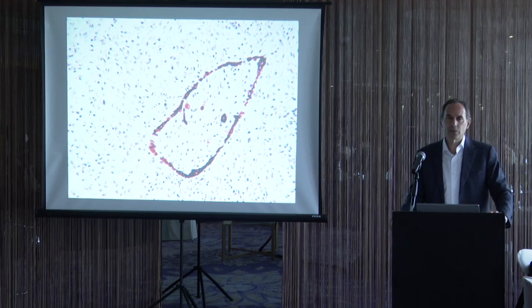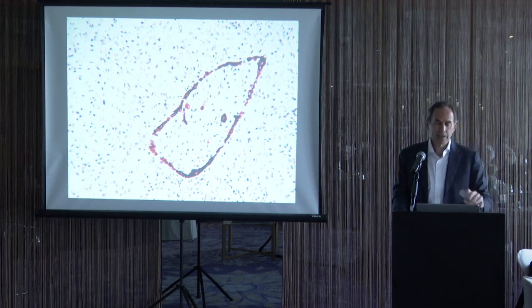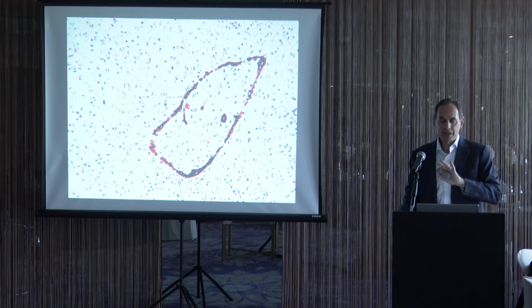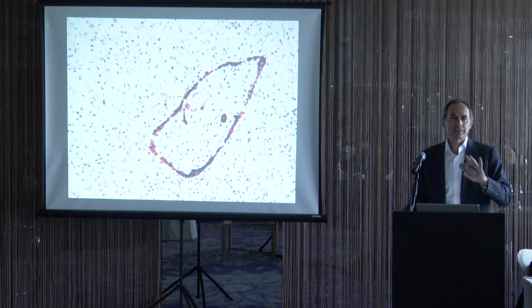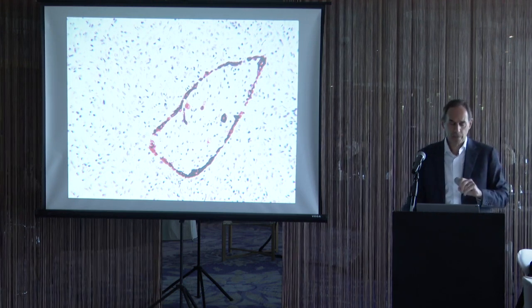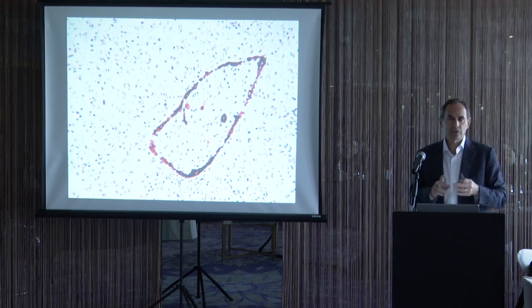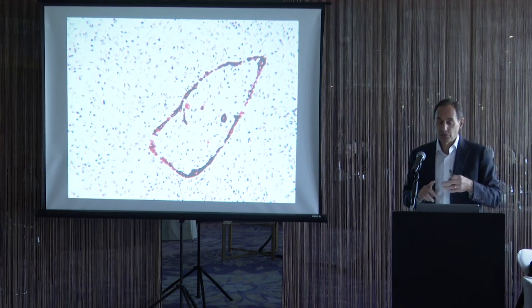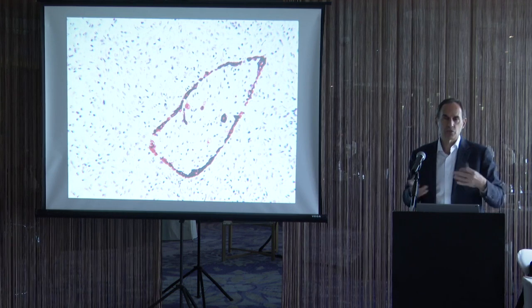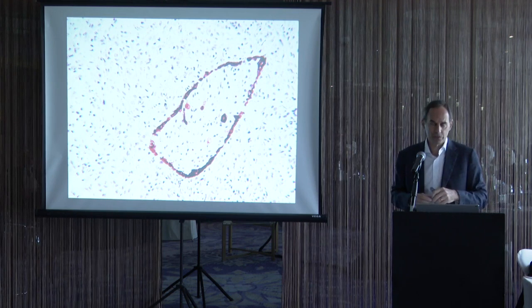But in one of the cases that I saw, a pathologist had misdiagnosed nonspecific granulomatous prostatitis and called it high-grade prostate cancer. They had done a PSA stain only, and the PSA stain had nonspecific weak staining in the histiocytes, and they used that to misdiagnose prostate cancer. So again, if you have a question whether these are histiocytes or cancer, do a CAM 5.2 on one side, but also do a CD68. Because if you do that, all these histiocytic cells will be strongly positive, and that should make you step back and say this is not prostate cancer.